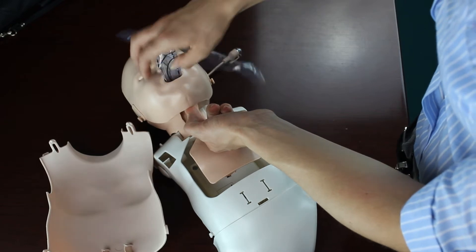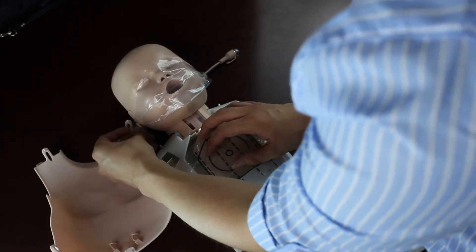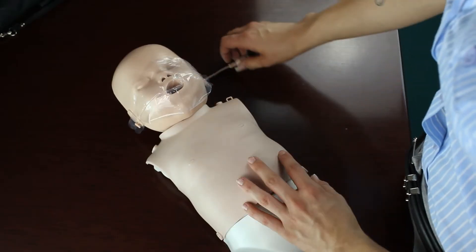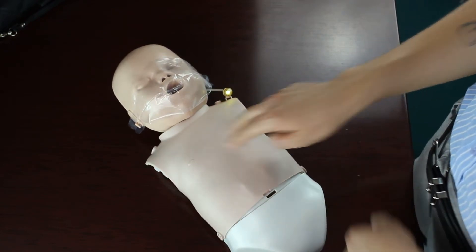Peel back the skin and install the lung bag and secure the face shield into place. Secure the LED sensor by attaching it to the loop on the left shoulder, and finally secure the head stabilizer and you're ready to train.